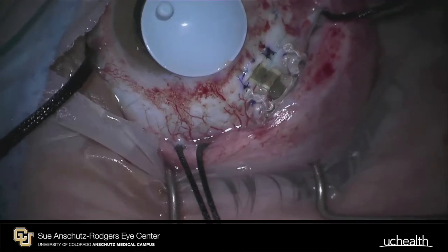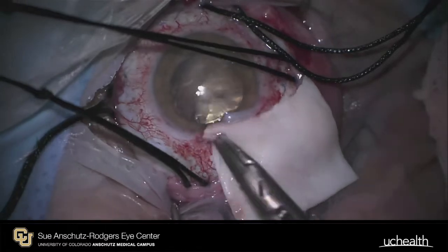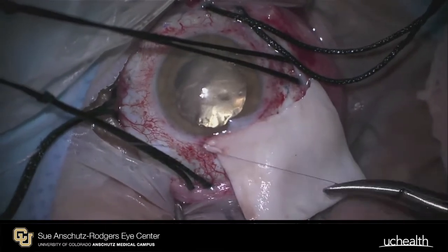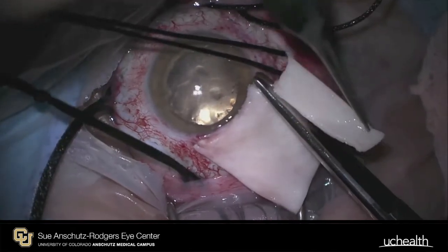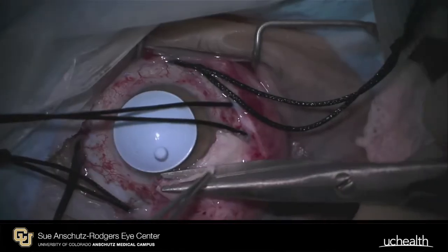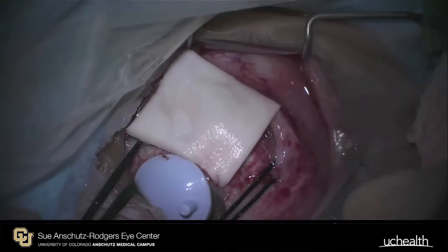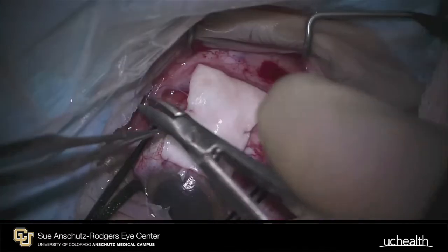Once the wound is assured to be watertight, the entire device must be covered with tutoplast. It is carefully anchored at the limbus, then trimmed to an appropriate size and deposited underneath conjunctiva. Similarly, tutoplast is placed inferotemporally to cover the antenna for the device.